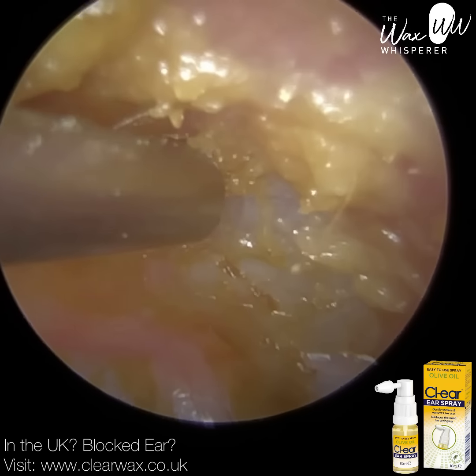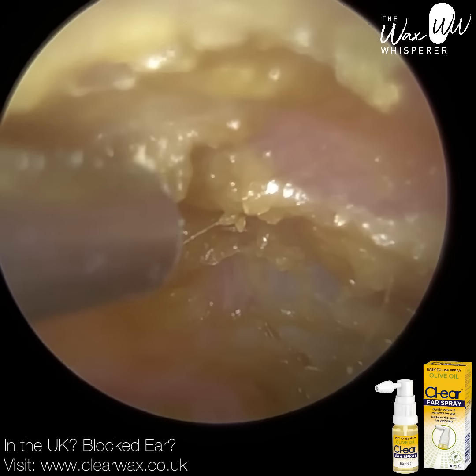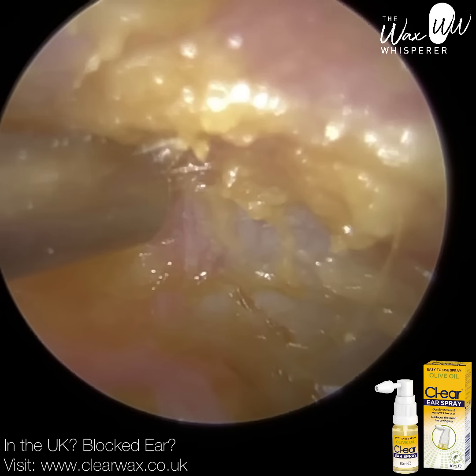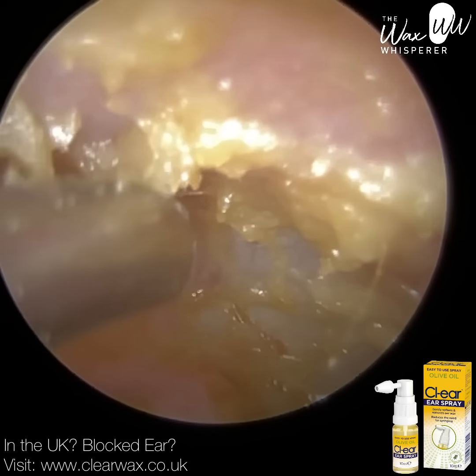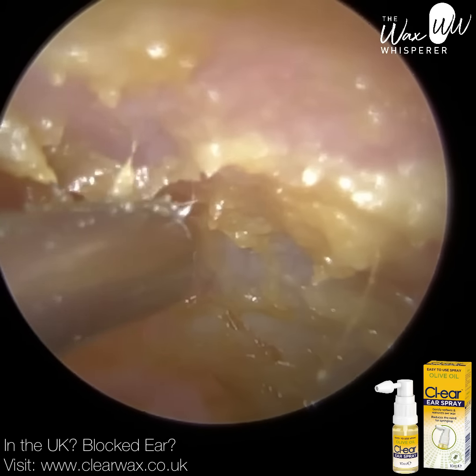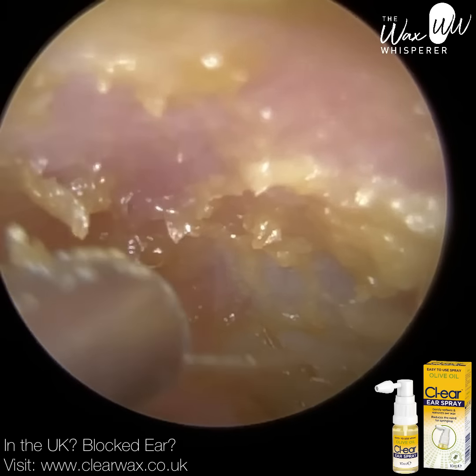I don't want to cause any further trauma to the patient's ear because it's already infected. The patient will need some antibiotic medication from their GP, which we've written to. Advise the patient to keep their ear dry because getting water in the ear can exacerbate any underlying infection or, in fact, cause an infection to be triggered.